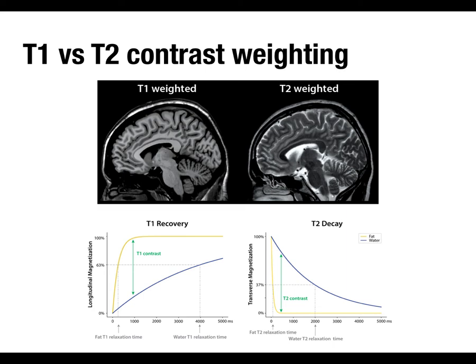So if you imagine, say, multiple sclerosis involves white matter plaques where the white matter, the myelin, starts to decay. And so you can imagine that in a T1 weighted image, what would you see as a symptom of MS, do you think? Less intact white matter? Right. So in terms of the contrast, you'd see like black spots or something inside what would normally be the white matter.